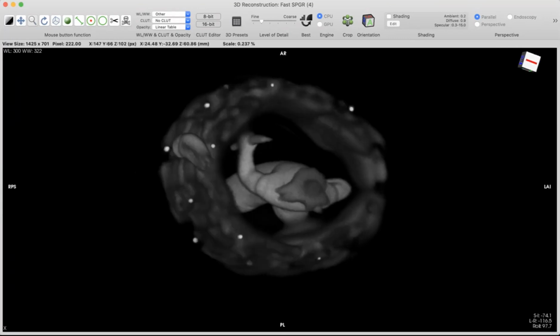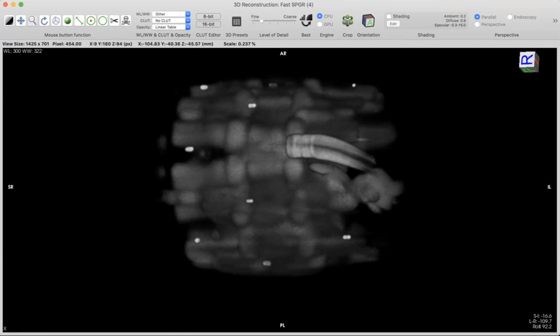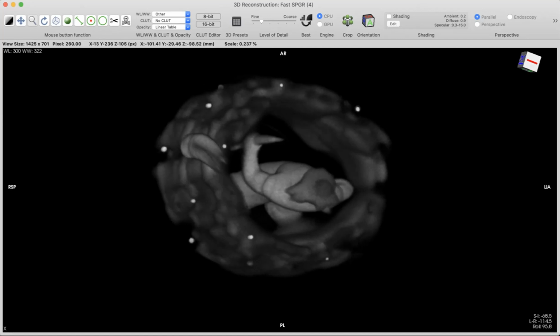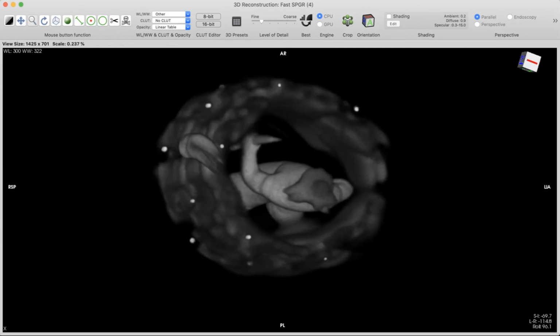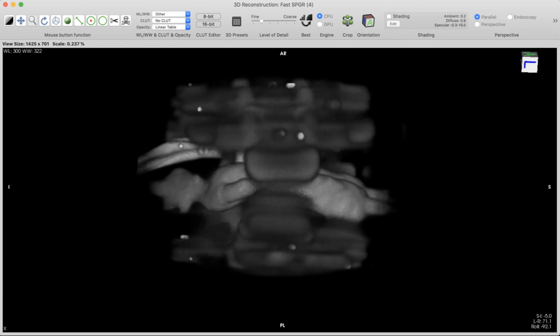And in particular, the cable that comes out, the cover of the coaxial cable, is made out of very flexible plastic. And that is actually the brightest thing here. And you can kind of see it here. And it's hollow because there's a conductor inside. See that it's hollow? But that's because of the conductor. So yeah, I thought it's pretty amazing. You can actually see the coil and Goku lying in the coil. Yeah. So safe and sound, no harm done, but still stupid.